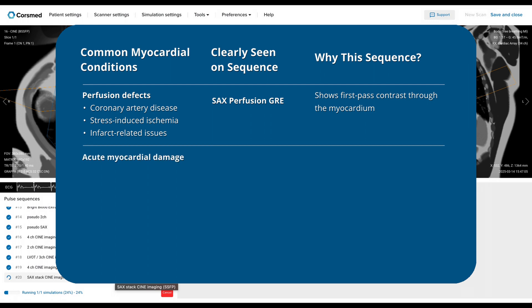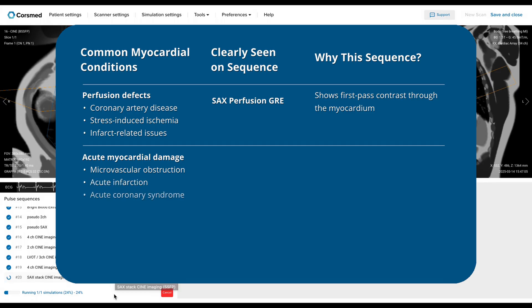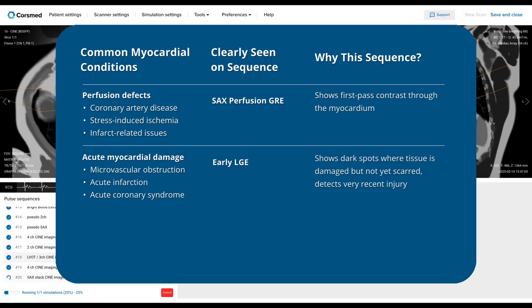Next we have acute myocardial injury conditions. This includes microvascular obstruction, acute infarction, and acute coronary syndrome. These early damages show up well on early LGE sequences. You'll see dark spots where there's microvascular obstruction — this is tissue that has just been injured but not yet scarred.